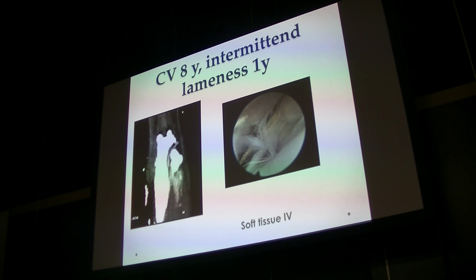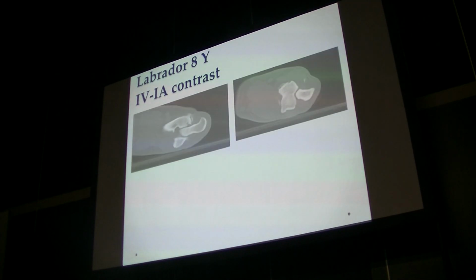So if they are chronically inflamed and if there are fibers present and an inflammation, they will cause a rupture of the joint capsule. And if you look using your scope and you see the triangle, so they are really looking upwards in the joint, you can see the fibers of the flexor tendons during arthroscopy of the elbow joint. So that's something interesting as well.